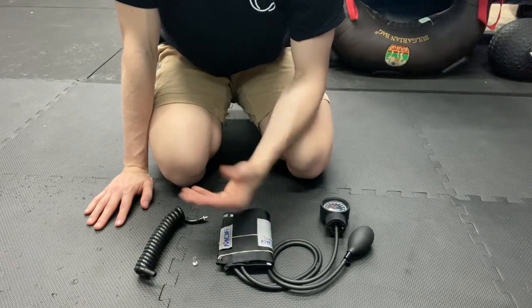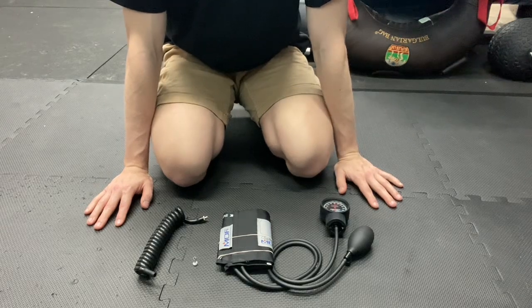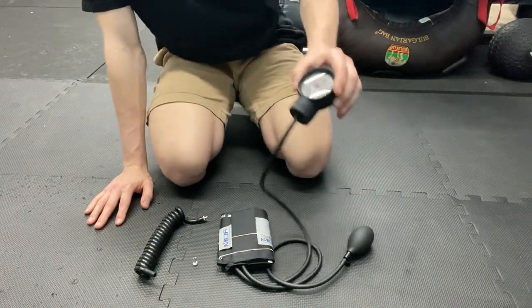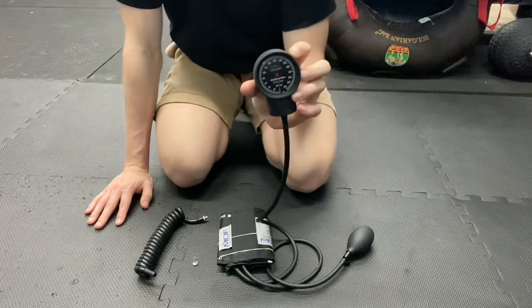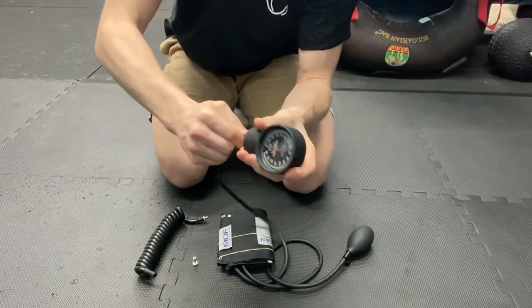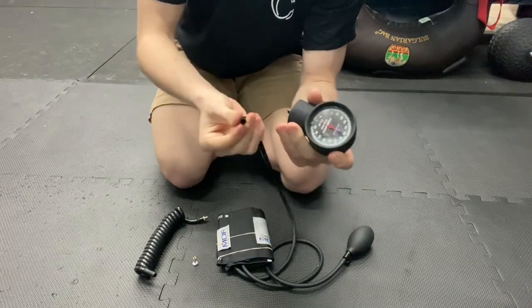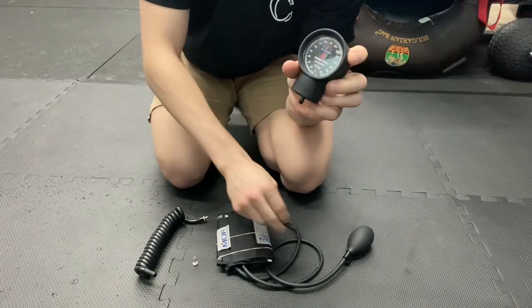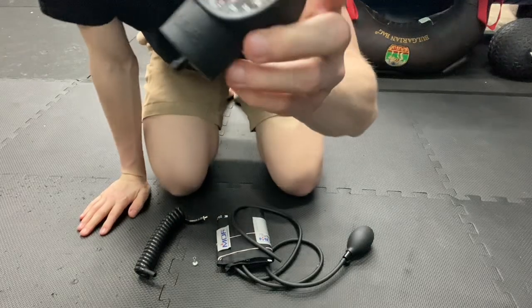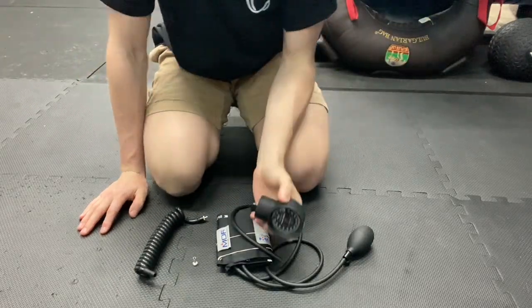And then once you get those in, now it's all about just putting it together, and it's very simple. We're going to take our gauge here, and we're going to simply just unplug the hose here. Don't be afraid to just pull it off. Sometimes it's a little easier than others. This is the adapter that you're looking for with this gauge. It'll work with pretty much any hose.